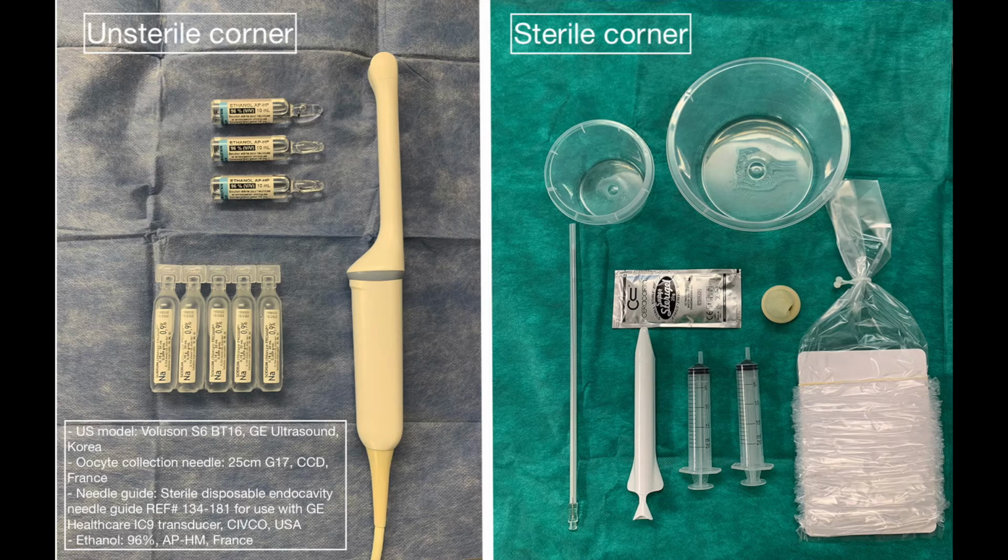We use a 17-gauge needle, but a 16-gauge can also be used to facilitate irrigation. A 3-way stopcock or double lumen needle may as well be used to facilitate suctioning and irrigating with different fluids without having to physically remove the syringe. An assistant is useful to avoid unwanted movement when the cyst has been punctured.